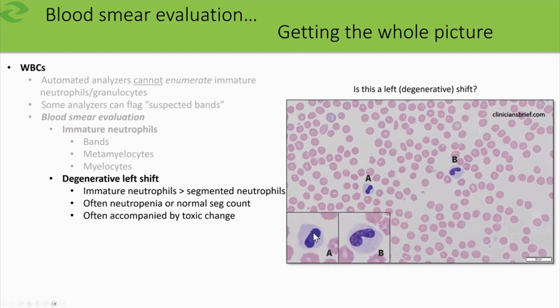This looks like a metamyelocyte, and this is either a late metamyelocyte or early band, depending on the definition of 2/3 parallel wall for 2/3 the length of the nucleus. Yeah, I don't know. Looks like leukopenic. There are lots of echinocytes here. I see a polychromatophil reticulocyte there, a couple of platelets scattered around. Don't see too much else going on with the red cells.